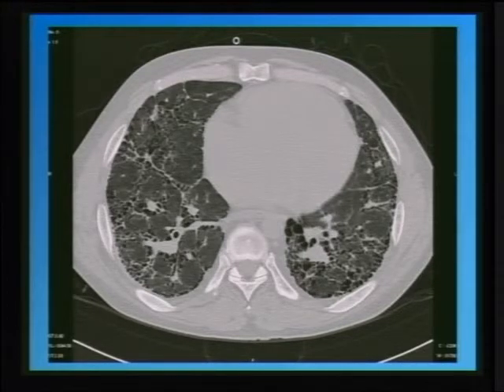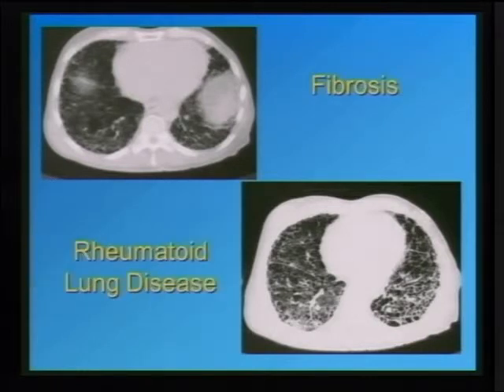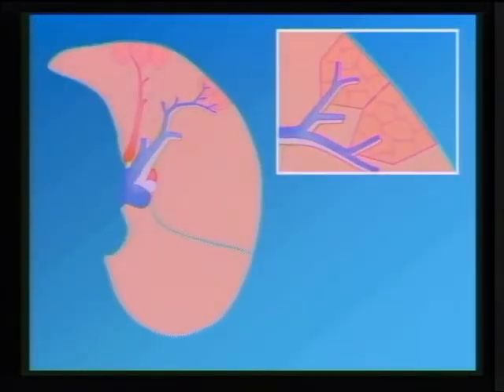In non-specific interstitial pneumonitis, you may have this cellular phase that does have these ground glass opacities that are a manifestation of inflammation. Those can be treatable. But when you have advanced fibrosis, they can give you this appearance that is not treatable. And probably what we need to do next is talk a little bit about the different entities of pulmonary fibrosis. So before I get to that, just the honeycombing.